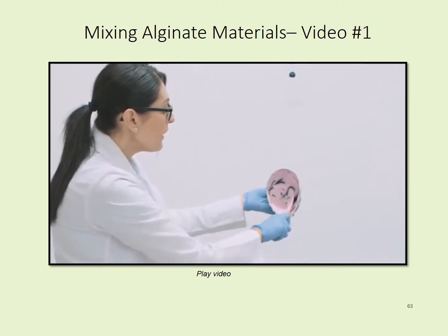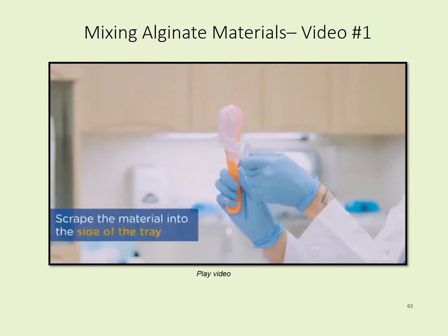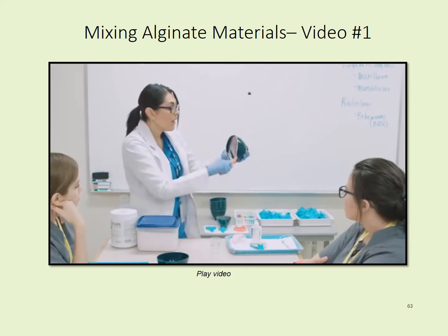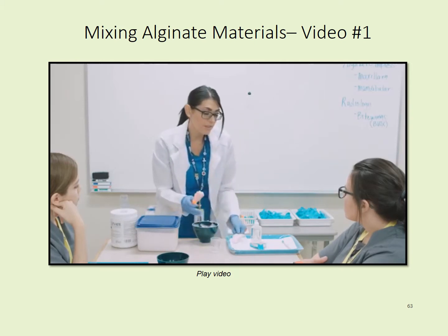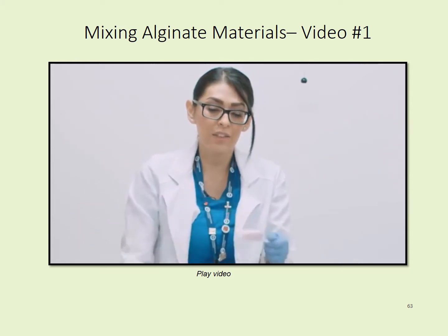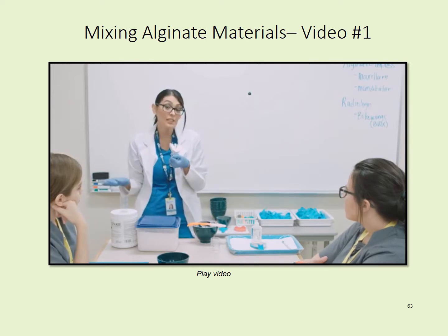So what you want to do is take a huge scoop of alginate material, take your tray, and use the side of the tray to help push the material in the tray, and then use the spatula to help spread it around. You want to go ahead and grab the next amount of alginate impression material and do it on the opposite side. All right, so once you have the material placed into the tray, sometimes it's good to use your finger to help smooth it out, because if it's all clumpy in here, when you take your impression, it's going to distort the impression.